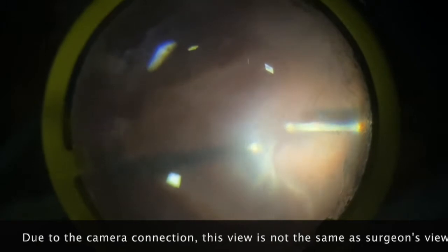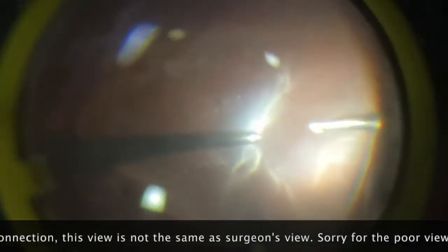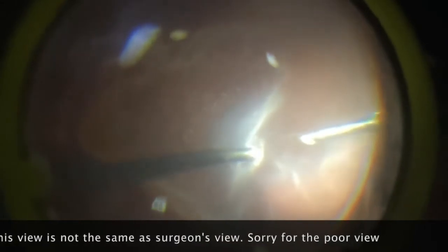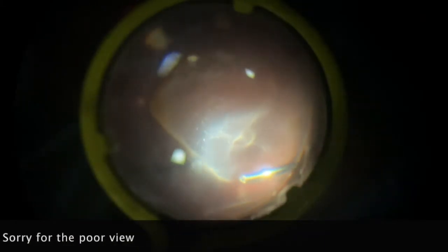Usually I would have started core vitrectomy to deepen the vitrectomy a little bit before I go to the posterior. But in this case there is pre-existing PVD, so I don't need to do that. So I'm trying to trim above the bulla so that the traction can be relieved and allow the bulla to retract.